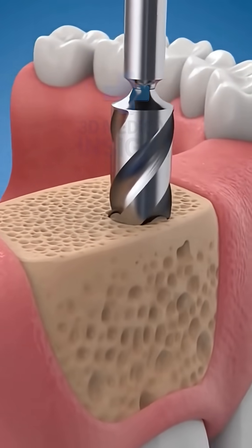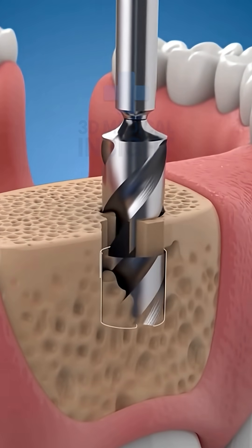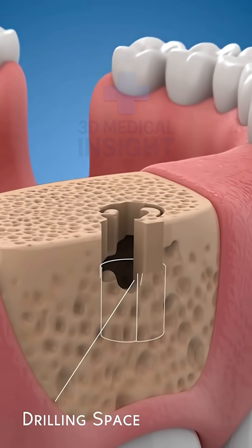A precise channel is drilled into the jawbone to create a strong base. This opening will securely hold the dental implant.